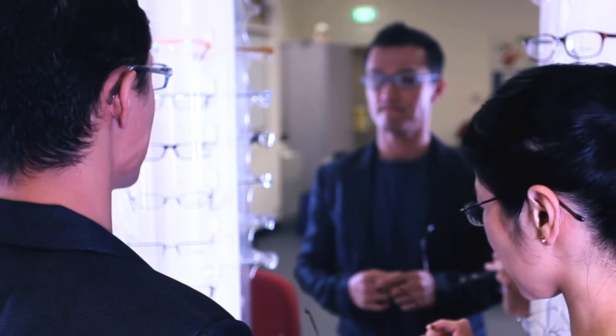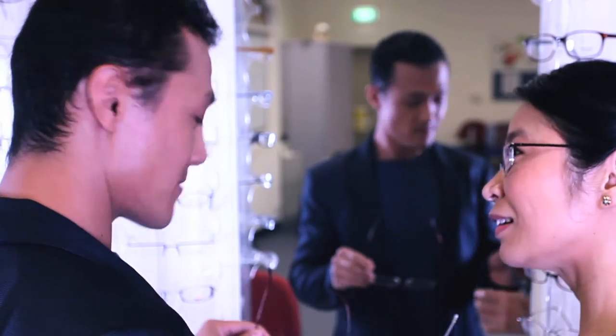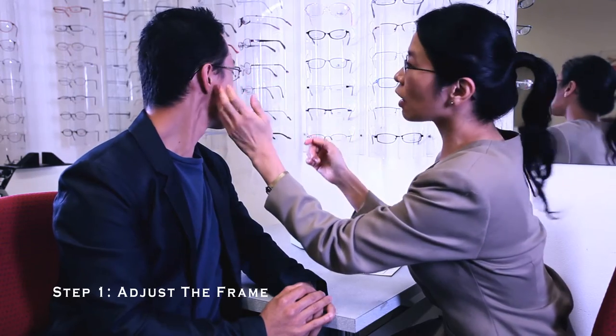Why don't you try these ones — I think they'll suit the shape of your face really nicely. Thank you. It is very important to ensure that the frame is in its final fitting position before you take any frame or lens related measurements.